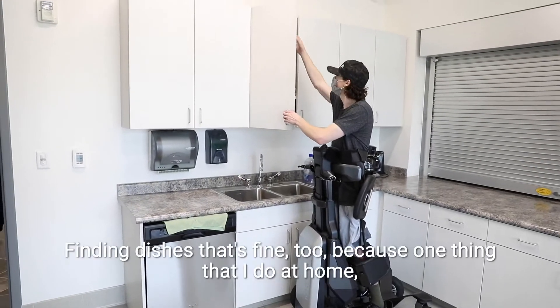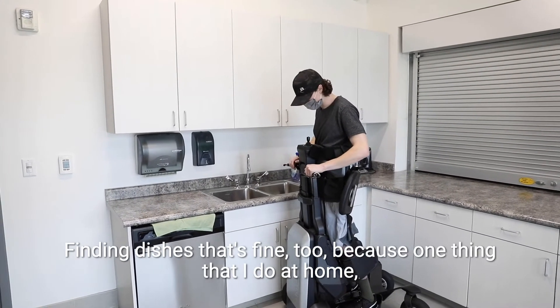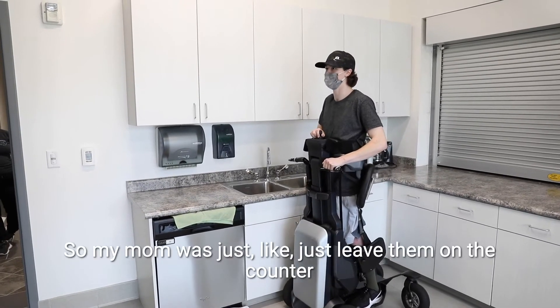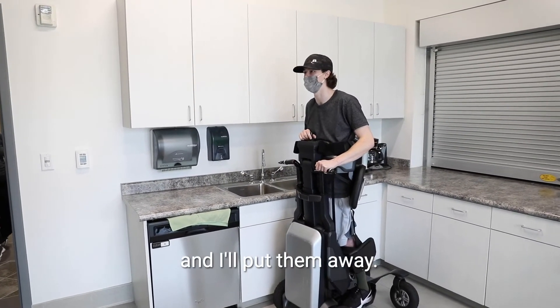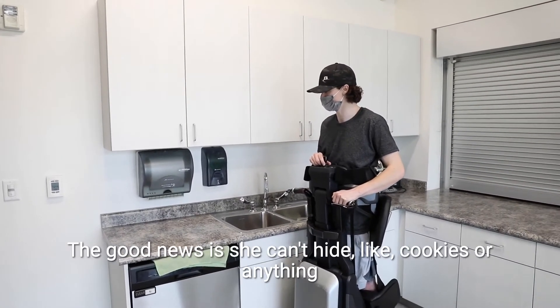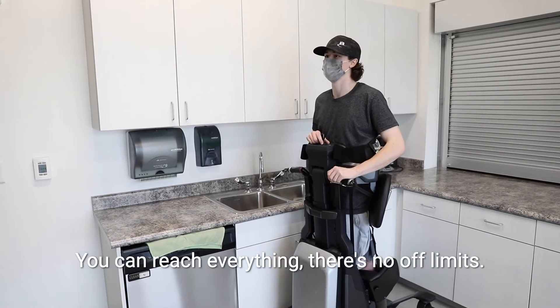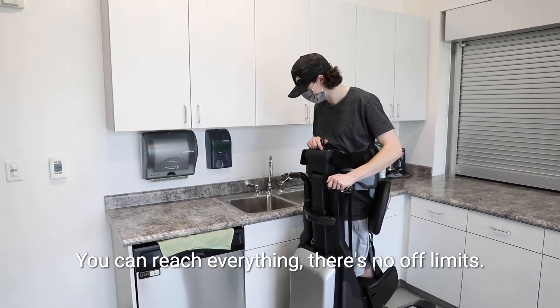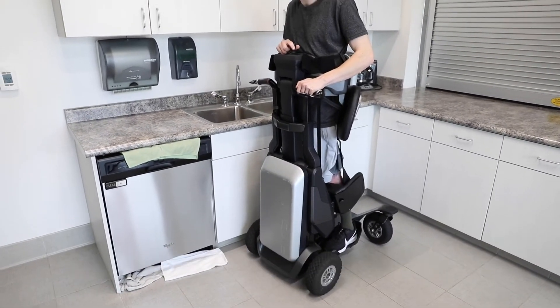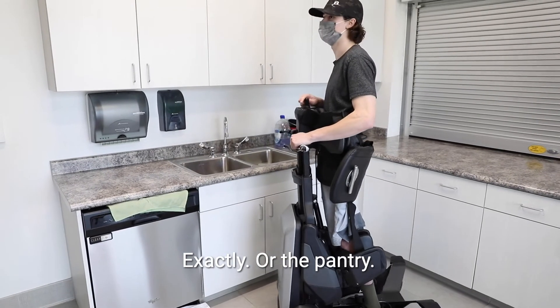One thing I can't do at home is reach the upper shelves, so my mom just leaves things on the counter and puts them away for me. Now my mom would say I can do it myself! The good news is she can't hide cookies up there anymore. You can finally reach everything — there are no off-limits areas, nothing to stretch for on the top of the pantry.